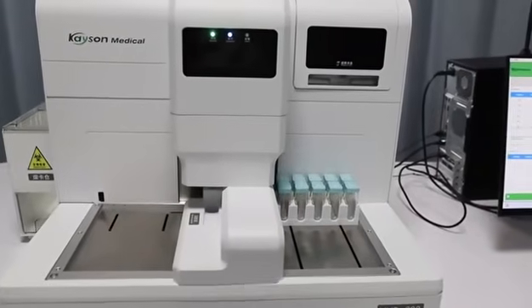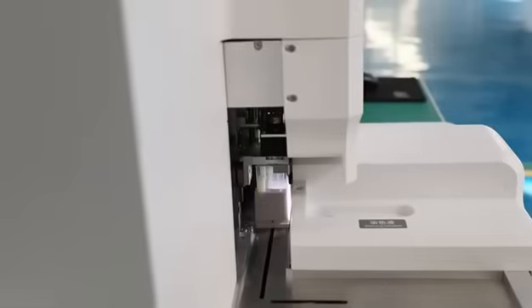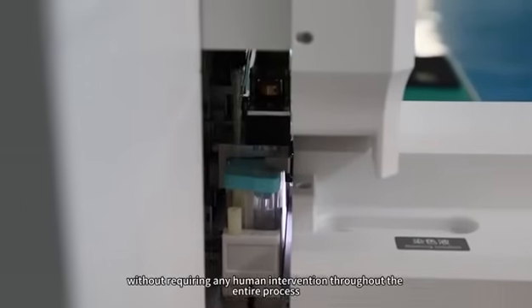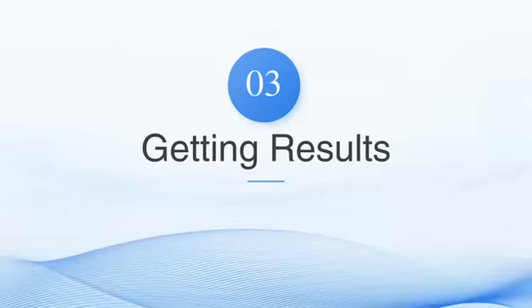Initiating Testing: after completing the above steps, click the Start button on the software interface. The device will automatically carry out the sample processing procedures, including adding liquid, mixing, and sampling, without requiring any human intervention throughout the entire process. Obtaining Results.